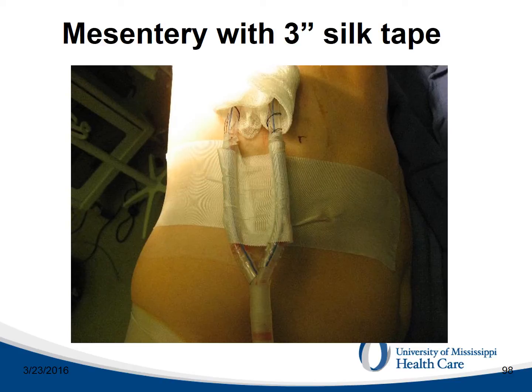As we said, the silk suture by itself is not enough to hold the chest tube in place. Therefore, several centimeters of a large 3-inch tape are firmly placed on the skin and across the chest tube, making a mesentery around the tube. This will hold the chest tube in place even if traction is applied to the chest tube during patient movements. Since sweat can make the tape loose, it needs to be checked every day during rounds and replaced if necessary.